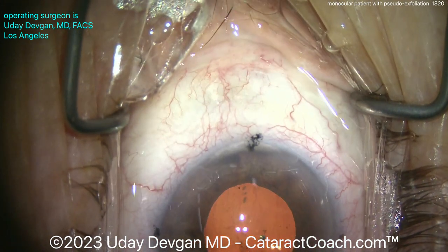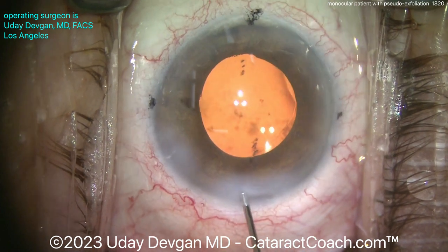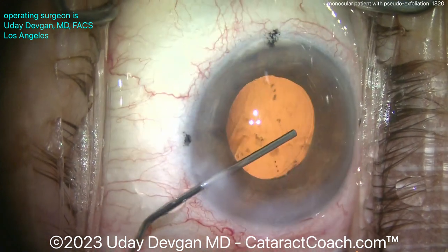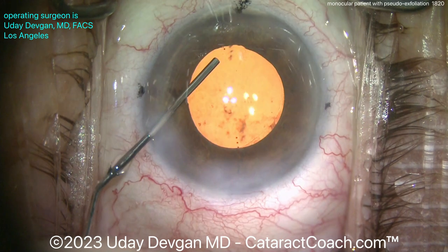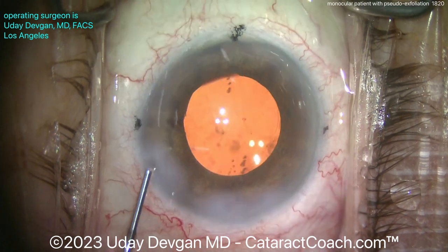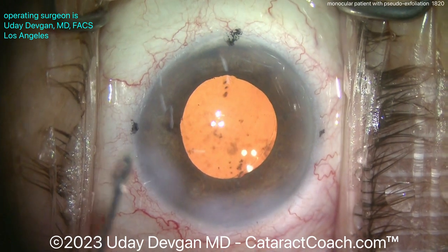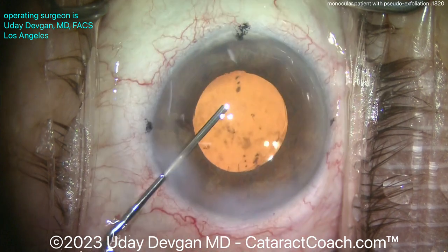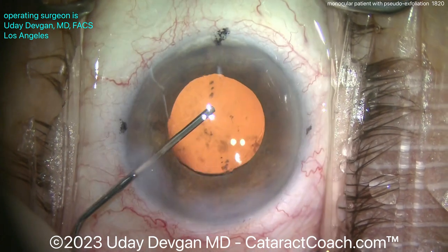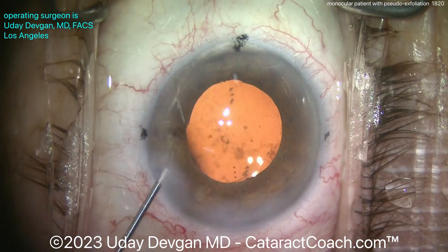Getting that lens lined up where we want it, doing a little more final checking, sealing up the main incision — it's a nice incision, no fish-mouth wound. Going inside the eye, sweeping around making sure there's no retained viscoelastic or lens material. Dialing that lens over just a little bit more to get it lined up just where we want it. Once the marks of the toric lens are lined up with the toric marks on the cornea we're good to go. The Purkinje images aren't perfectly lined up right now due to a little parallax, but a little more sweep and BSS injection underneath the iris to check for retained lens pieces.